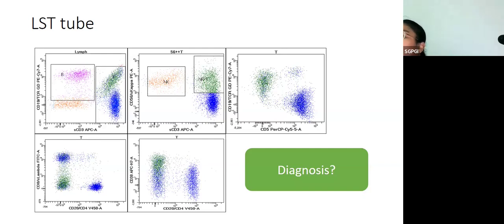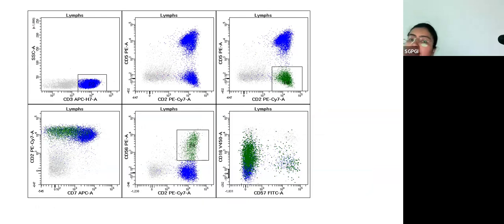So gamma delta proliferation or gamma delta lymphomas, if we think on top of our head, would be hepatosplenic T cell lymphoma, subcutaneous panniculitis T cell lymphoma, which this presentation would not justify. And there is the cutaneous gamma delta proliferation, again does not justify. So very likely with the presence of the splenomegaly, with this pattern you're dealing with hepatosplenic T cell lymphoma.